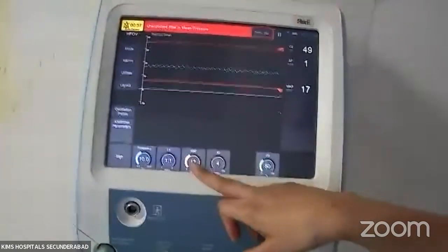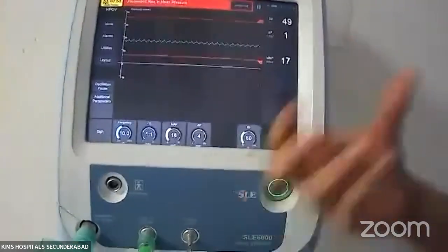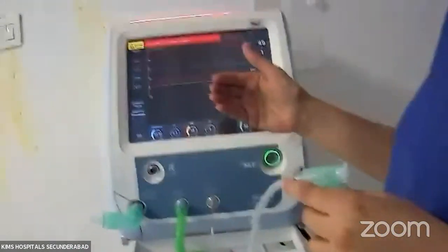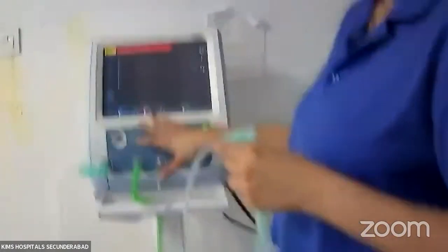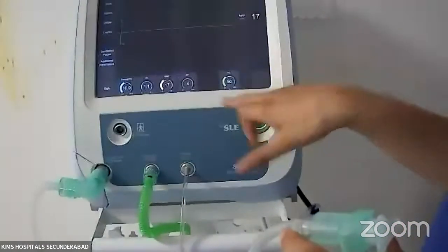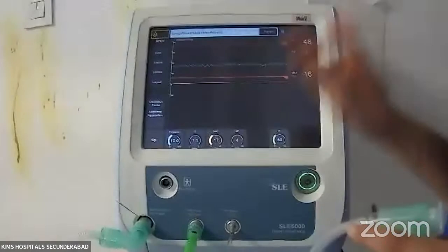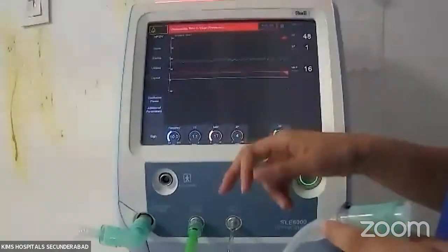So I told you that when we move from conventional ventilation due to severe parenchymal lung disease like pneumonia, RDS, or severe PPHN, we will choose a MAP which is 2 to 3 centimeters higher than the MAP on conventional ventilation. So for example, let's assume this term baby, we are switching from a MAP of 14 on conventional. We will begin with maybe 16 or 17 of MAP. Generally, we set the FiO2 at the same FiO2 as on conventional ventilation or maybe 20 to 30% higher, because usually we are switching to high frequency itself because there could be hypoxic respiratory failure.